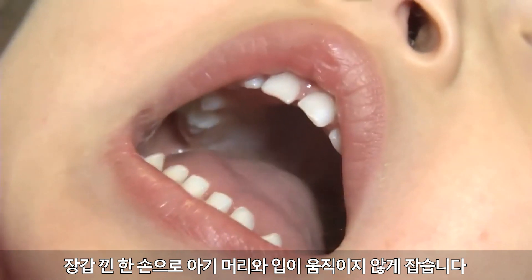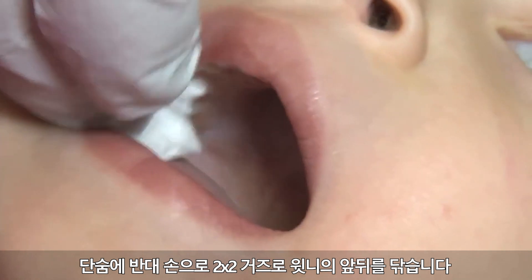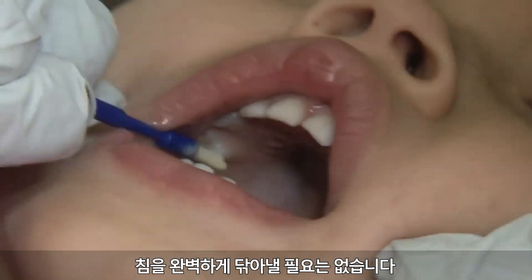With gloved hands, secure the child's head and mouth with one hand. In one motion, use the other hand to dry the front and back of the top teeth using a 2x2 gauze. The teeth do not have to be completely dry.